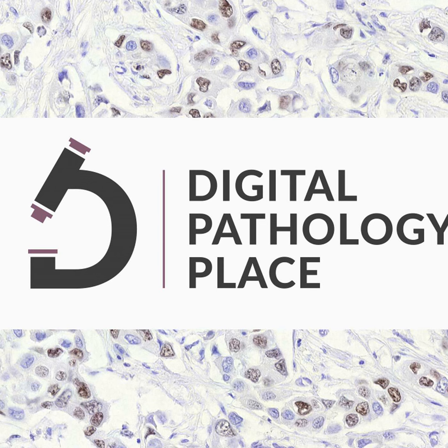So the FDA, for example, has been focused on the entire pixel pathway. Scanners have to be married with archives and display software and display hardware to develop the full pixel pathway end to end. That's basically why the FDA pushed the Philips system to be such a closed system. Yeah, and the Leica system has to be coupled with its own viewer, and the FDA has approved third-party viewers, one for the Philips system and one for the Leica system.